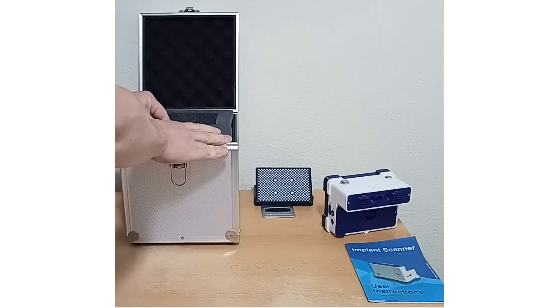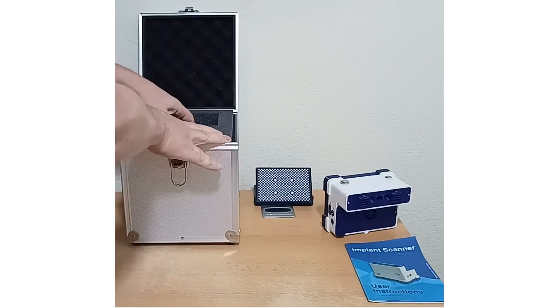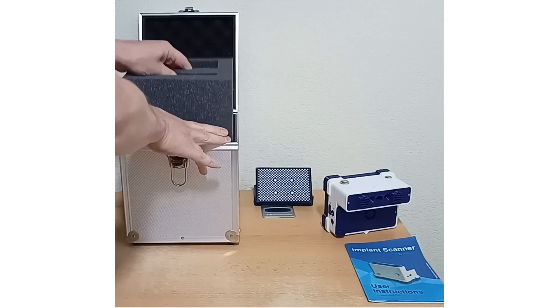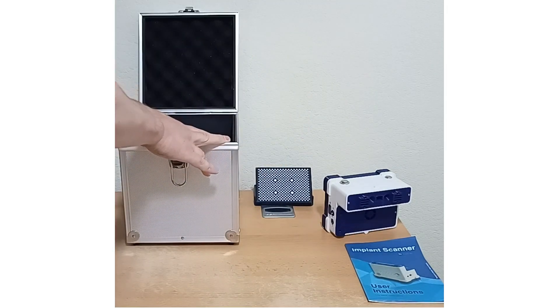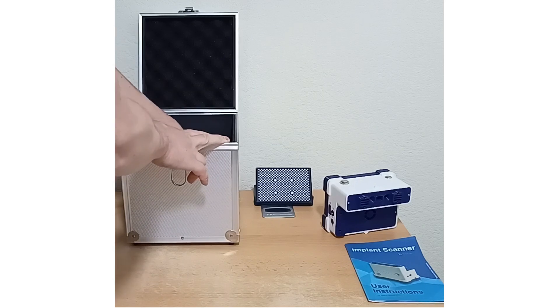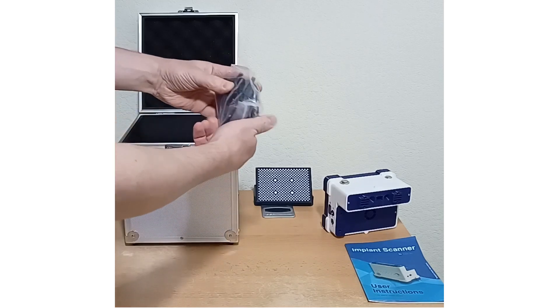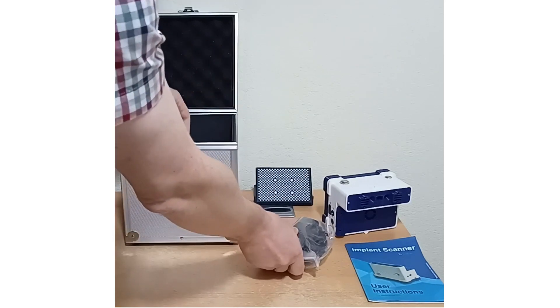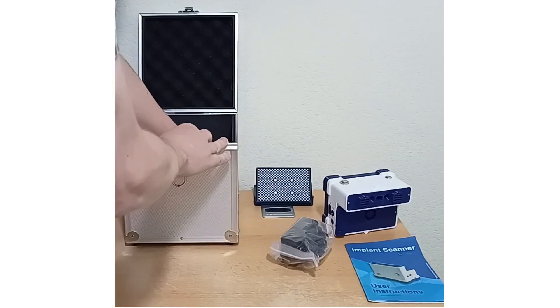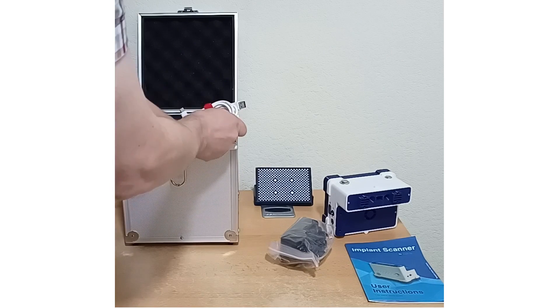Underneath you have the power supply for charging the internal battery. That's for the UK, but we ship the right one for your country.